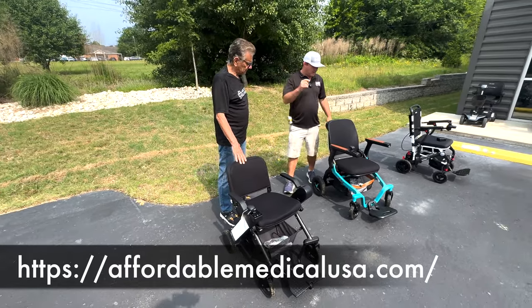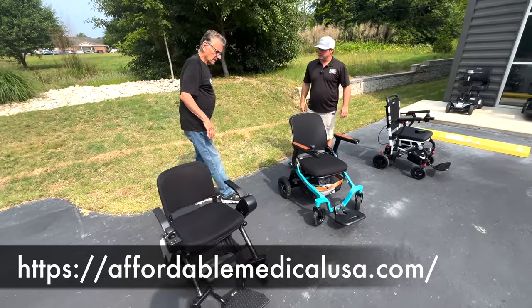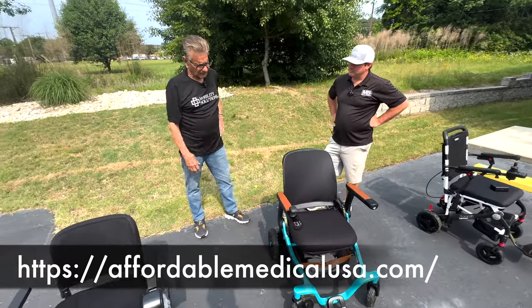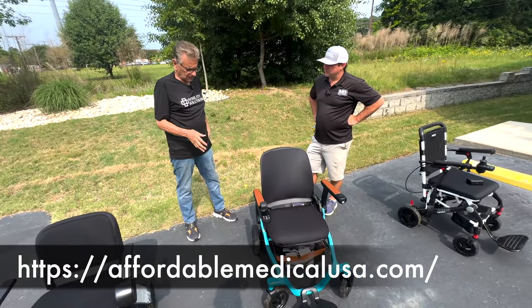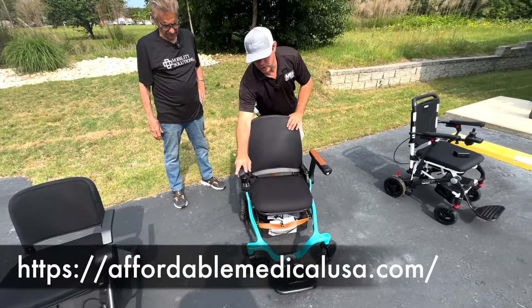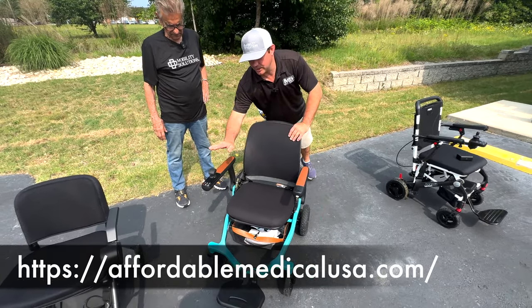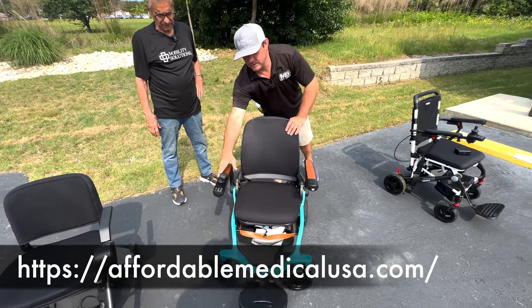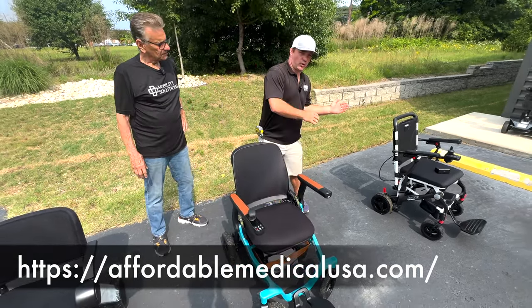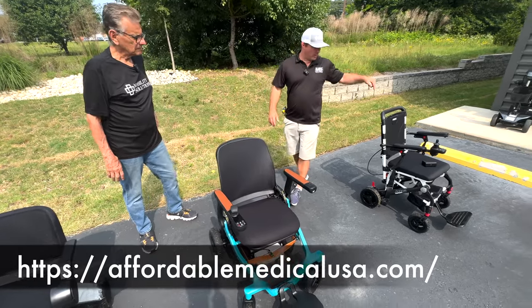Okay. Then you rode this one. How'd this one do? This one did the same thing. It has the same kind of power, except the turning was a little difficult. The acceleration's a little slow, so you have to go forward a little bit. That's a good thing, especially if you're using it inside the house, because it doesn't jerk real hard on you.